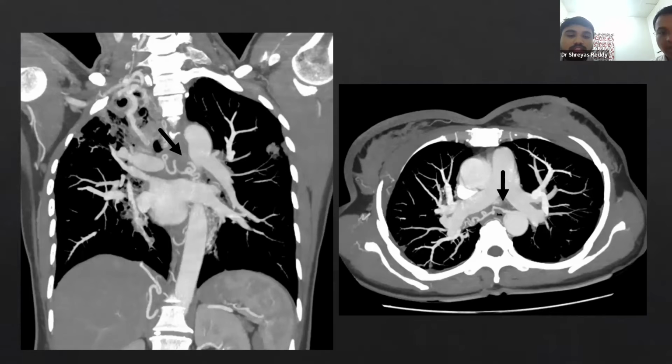Okay. So now the ER team or the emergency team asks you to go for bronchial artery embolization. How will you proceed and what are the things that you will see in this case to say yes for taking this patient up for bronchial artery embolization? First, we'll look at the general patient parameters, bleeding parameters and all that. Once that is clear, we will be reviewing the images. We will first try to identify the bronchial arteries, see if they're hypertrophied. What is the size criteria? Anything more than 2 mm is an embolizable vessel.